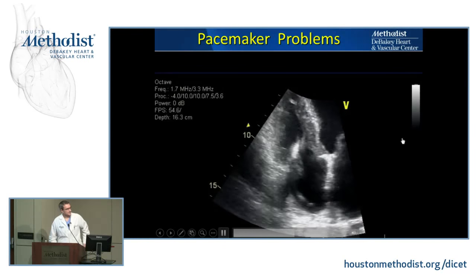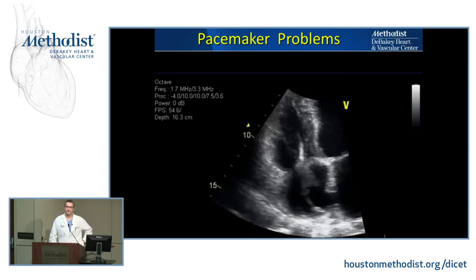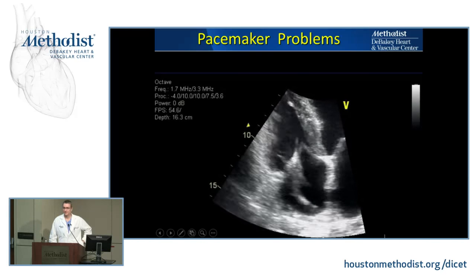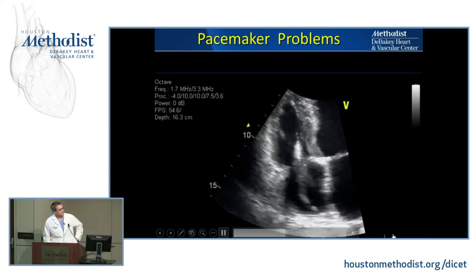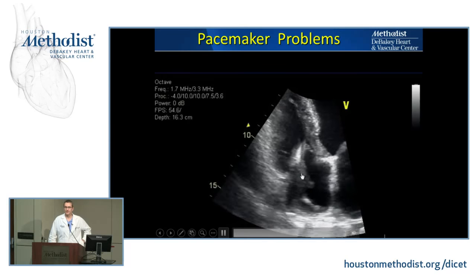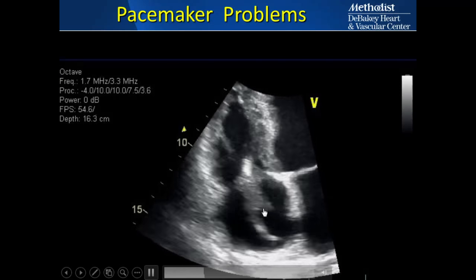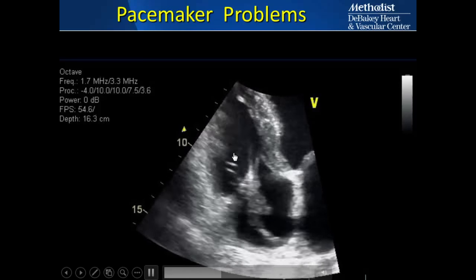Okay. So this is one of the things that's happened in endocarditis in the last couple of decades: with our proliferation of indwelling hardware, we're seeing a lot more prosthetic device endocarditis. So this is fairly typical of a pacemaker. And when you first look at this, it's very hard to know, is this thrombus or is this infection? Is it a vegetation? So in addition to this very large, bulky thing that is adherent here, you've also got another mass that's sort of bouncing around. You see it from time to time in the ventricle.